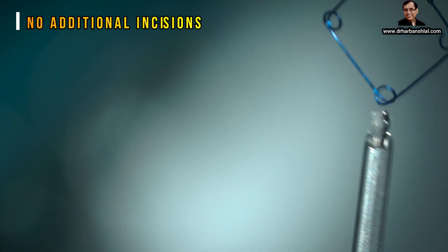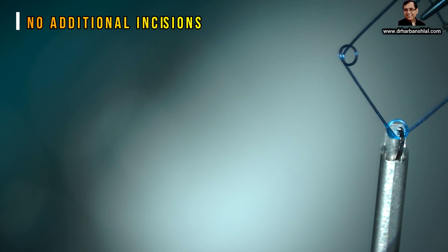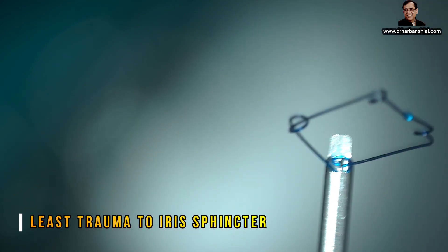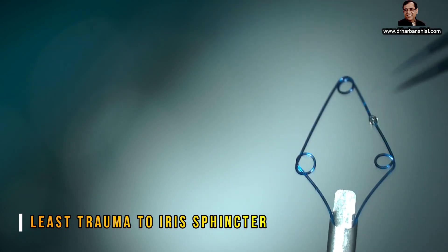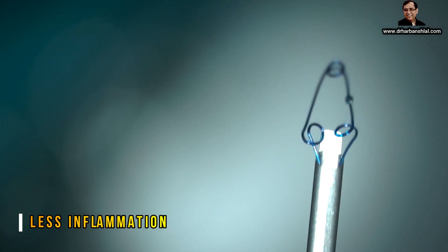You don't have to make additional openings as in the case of the iris hook. It can go from the main port.